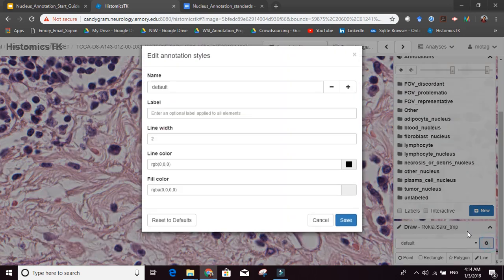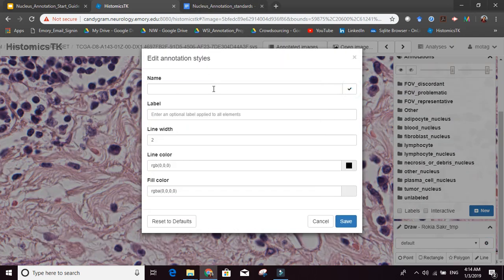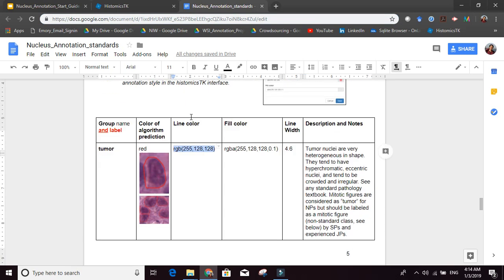So I'm going to create an annotation style, and I'm going to say this is tumor. Then I look at this document and it says tumor has this RGB value for the line color.